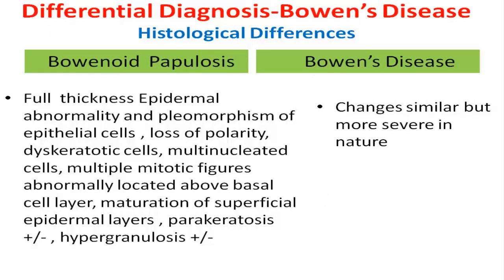Histological differences between these two conditions are minimal, but are more severe in Bowen's disease as compared to bowenoid papulosis. Both are characterized by full thickness epidermal abnormality and pleomorphism of epithelial cells, nucleomegaly, high nucleocytoplasmic ratio, loss of polarity, presence of dyskeratotic cells, multi-nucleated cells, and multiple mitotic figures abnormally located above the basal cell layer. However, bowenoid papulosis shows maturation of superficial epidermal layers, in contrast to Bowen's disease.